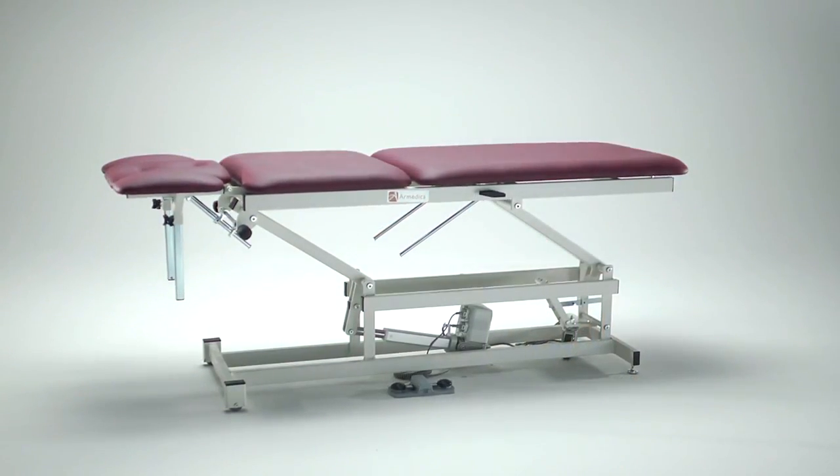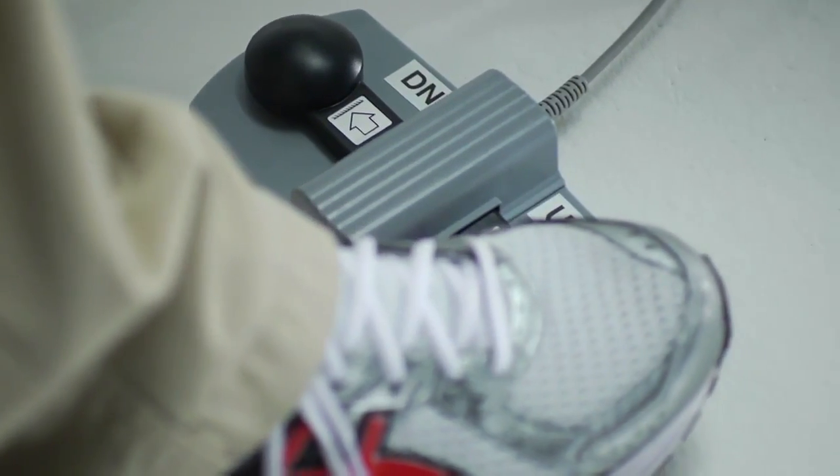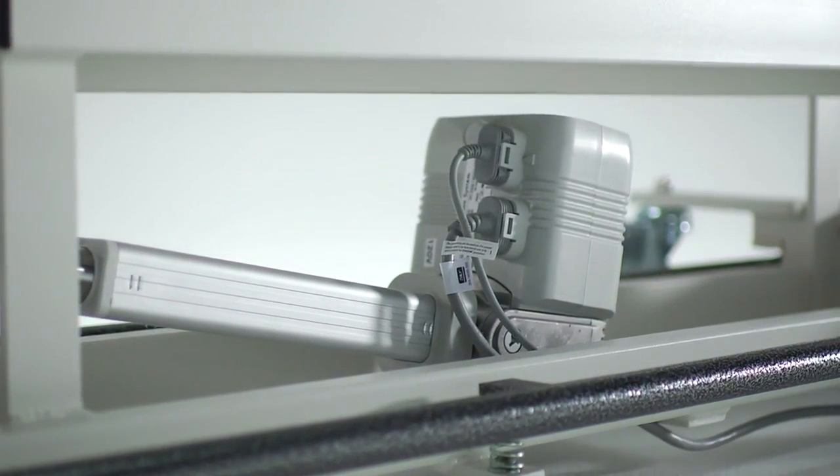This is the AM555. It is equipped with our standard footswitch high-low control and power-assisted caster system. Our standard motor is rated for 1,798 pounds of force.